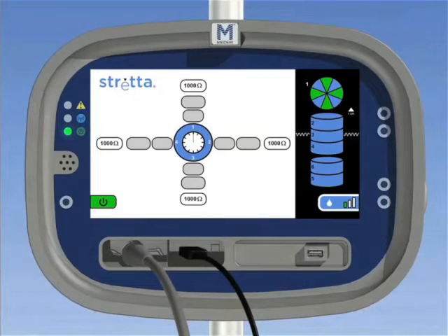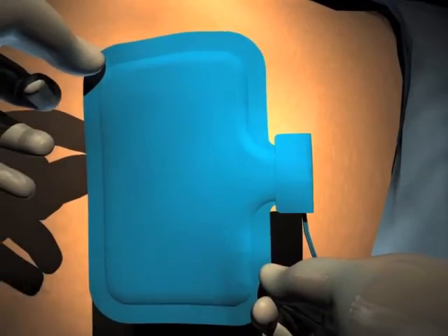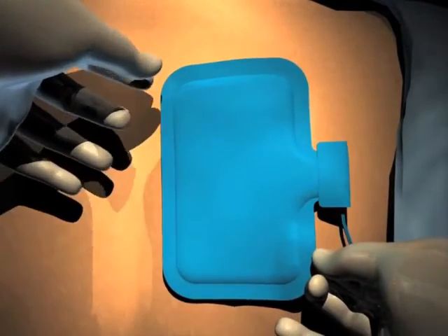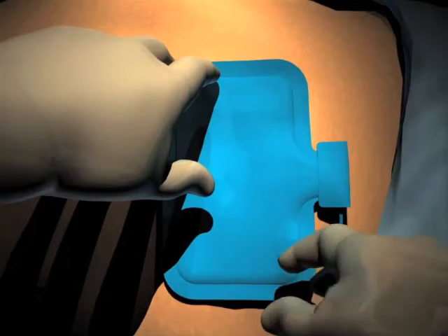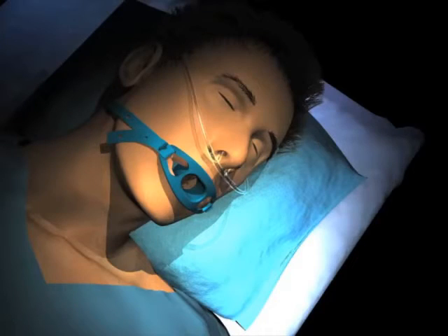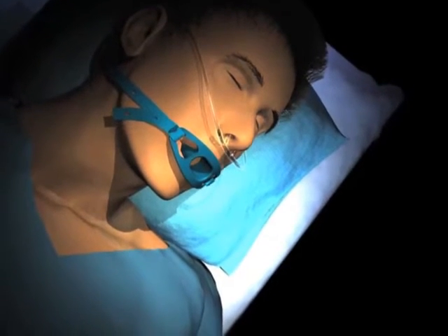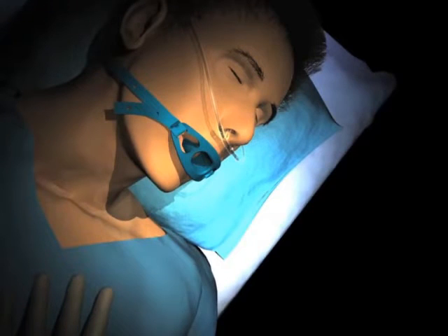17. The physician may elect to modify these suggested steps for patient preparation. 18. Prepare the patient using standard technique for monopolar electrosurgery. Apply the return electrode pad to a cleaned and hairless area on the patient's right mid-scapular area off the midline. 19. This area must be clean and hairless to ensure proper electrical contact. Prepare the patient for a standard upper endoscopy. The patient should be placed in and remain in the neck extended position to maintain consistent measurement and treatment placement.